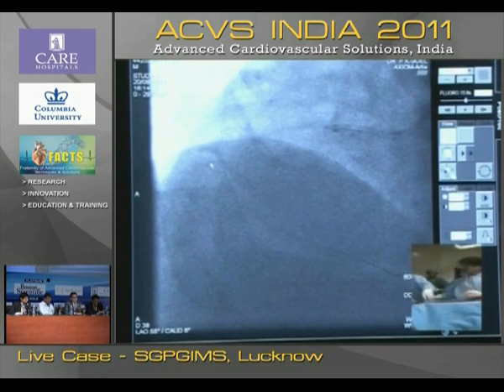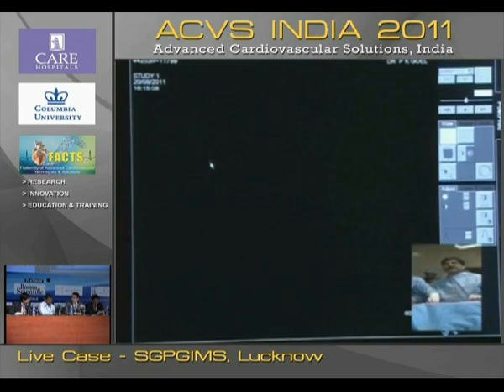I think we'll just use that, that's a good result. You can go ahead and stent it now.